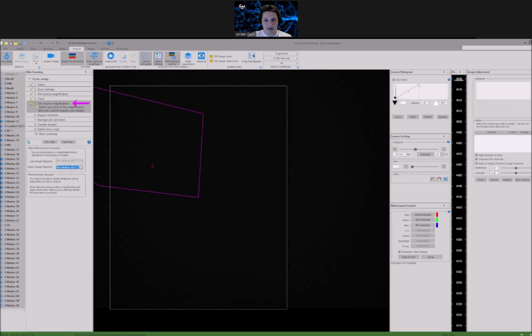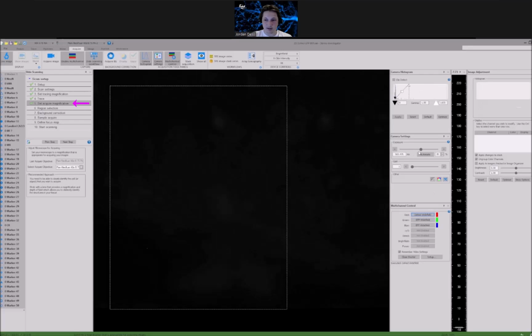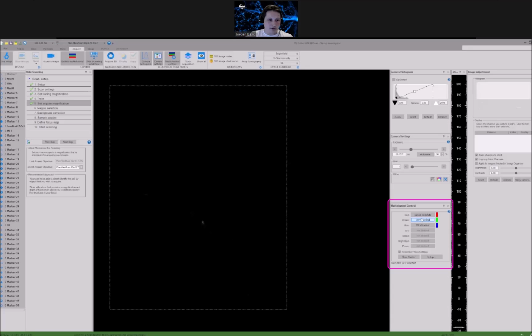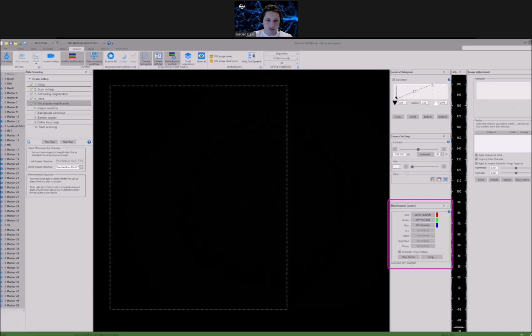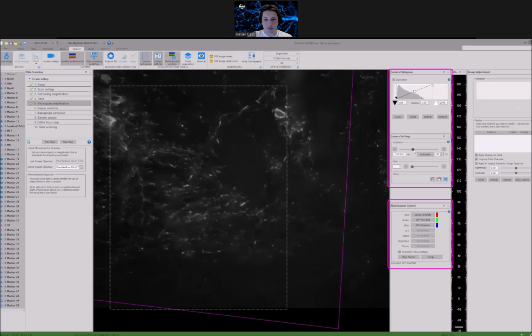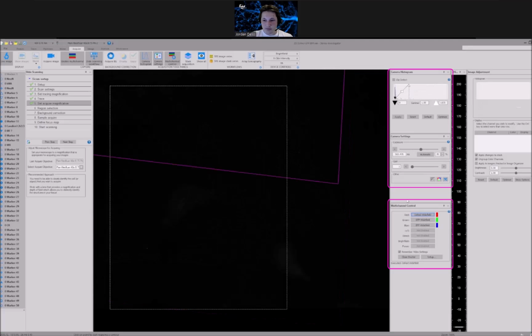In the next step, I'm going to set my Acquire magnification. This is the magnification the slide is going to be imaged at. I'm going to choose to use 40x to create that high resolution image. I'm also going to use this time to help set up my multi-channel acquisition settings like Jean presented earlier. Similarly, I'm going to be using the DS-Red, GFP, and BFP channels, adjusting the black and white points and getting a good exposure for each channel before moving on to set my base point for my scan.